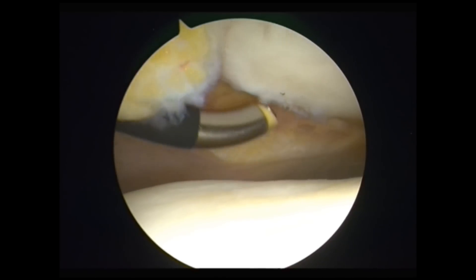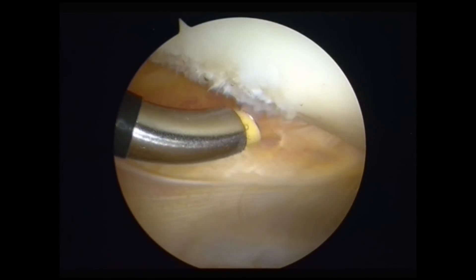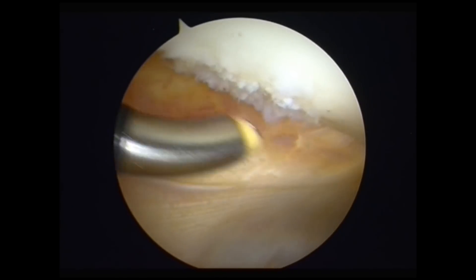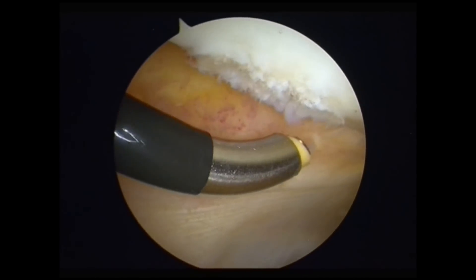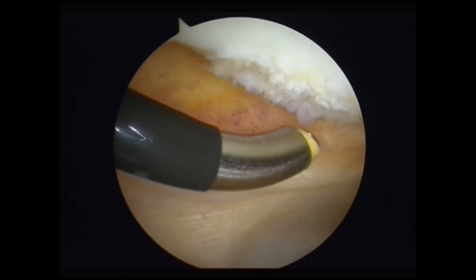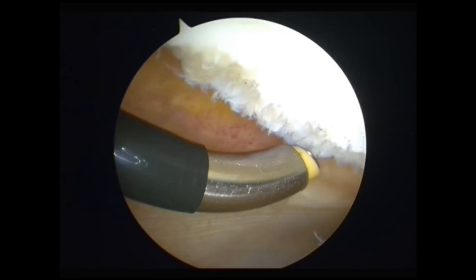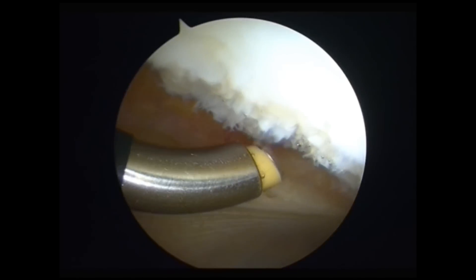There's suction on this SuperMultivac 50 so that the products of vaporization are all sucked away with the synovial fluid. If you see a little synovial tag like that — some synovitis — that can easily be vaporized and removed. If you can't get the wand to the area you want to vaporize, then you've got to move the patella to the wand itself.